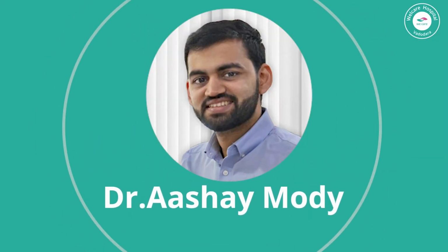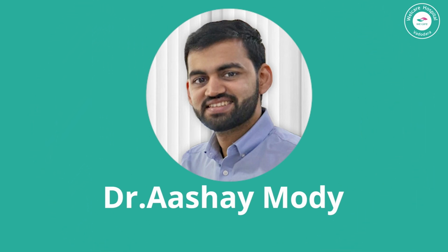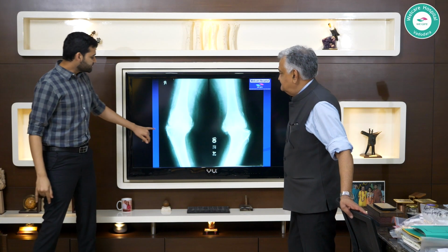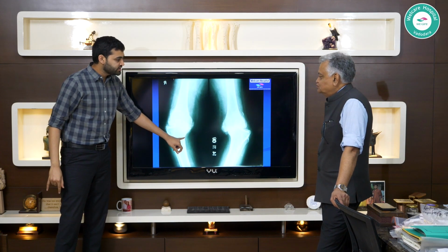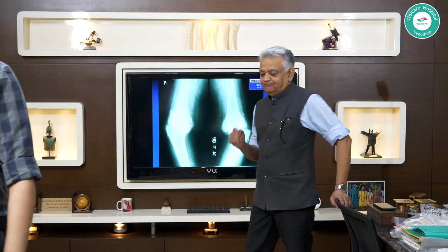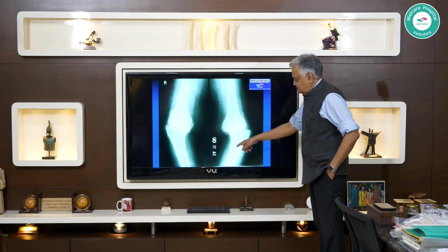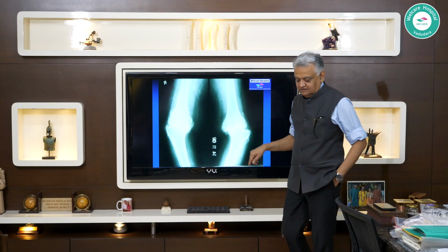Next please. No, I have a doubt while we're on the deformity. There has always been a slight confusion when talking about varus deformity. Those rare cases when the deformity is not in the shaft, but it is at the metaphysis. Very good. And that is very dangerous when we are putting the jig and we are taking a cut, and we don't realize if the deformity is at the metaphysis or is it the whole tibial bone. So how to go about it? Super. That's a super point he brought out. I had it in mind, but I would have missed it.